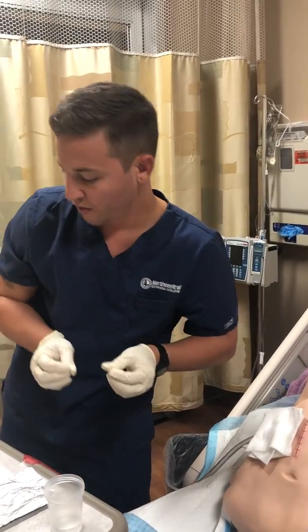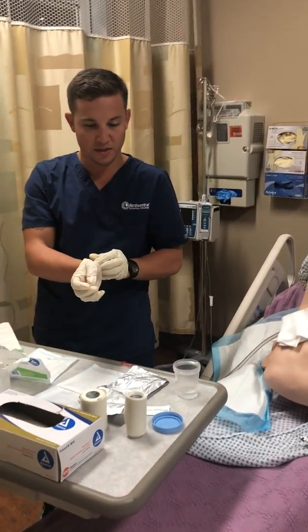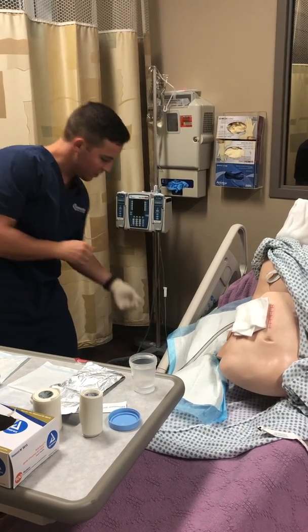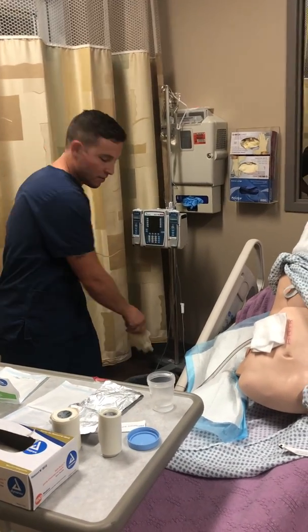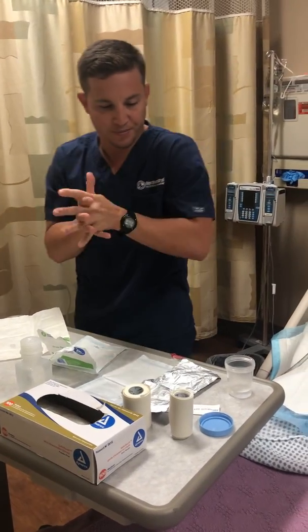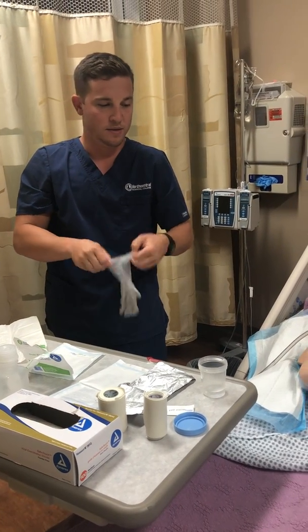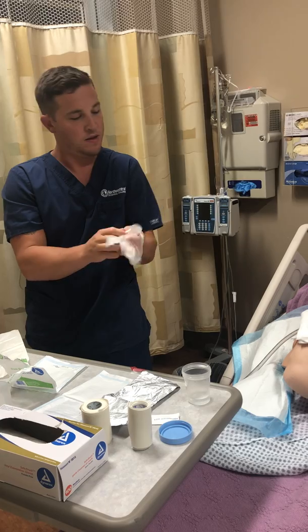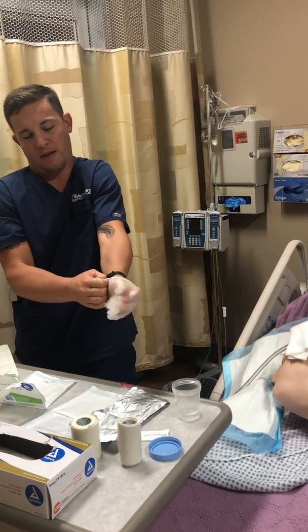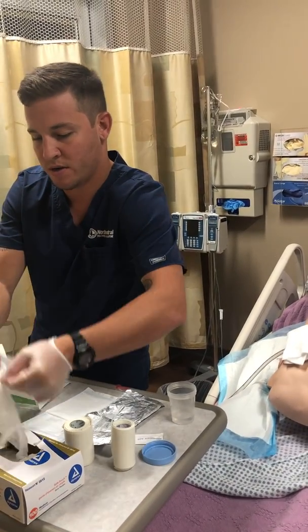Okay, so here I got Vaseline all over my hand, my gloves here, so I need to get a good grip of my tape. So our sterile technique now has ended. We're going to wash hands, put on clean gloves.